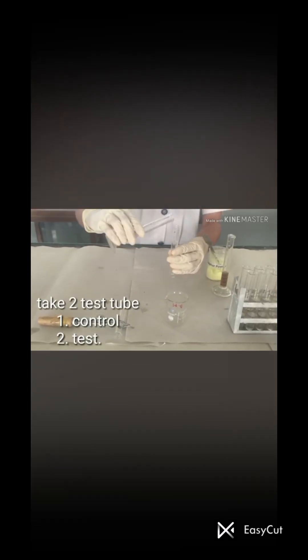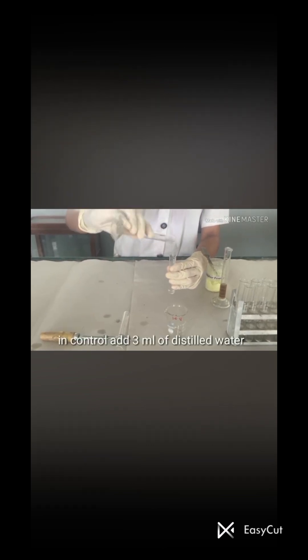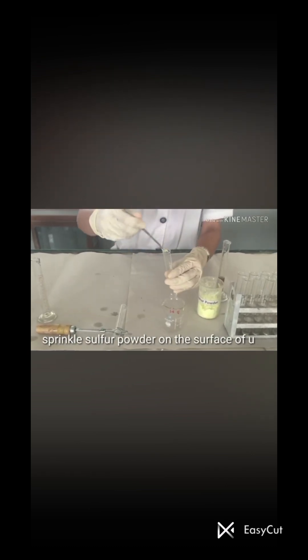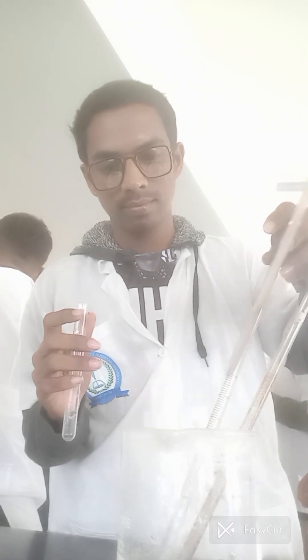Now let's see how to create the control. First, we take a test tube and add 3 ml of distilled water. Then we sprinkle sulfur powder on the surface of the distilled water. This is the control.